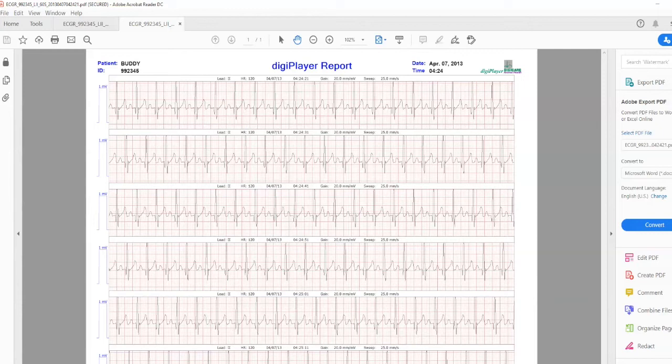The ECG report includes the patient name, ID, date, time, and report length.